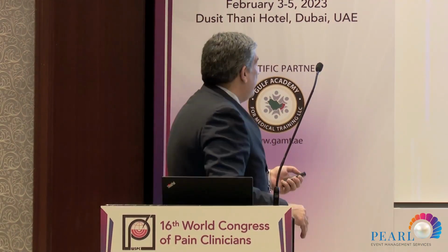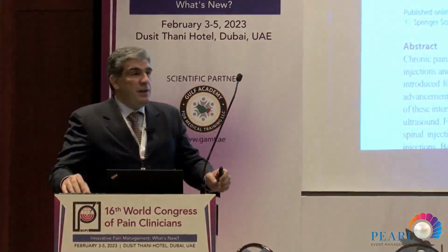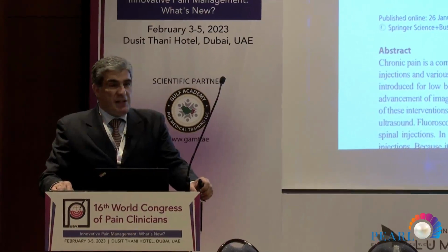Today we'll be discussing the ultrasound foraminal technique, a new technique, focusing on the safety and the accuracy of this technique. So first, looking into the literature, you can see that ultrasound, starting in 2005, is a validated technique in transforaminal steroid injection. You find many articles comparing it to fluoroscopy and to CT scan. It has a lot of advantages, but still needs a lot of improvement because it has some pitfalls.